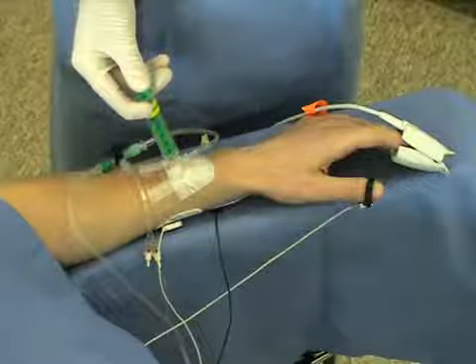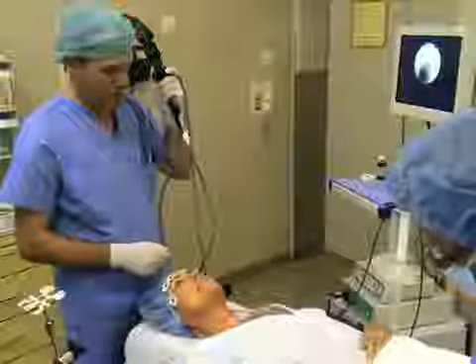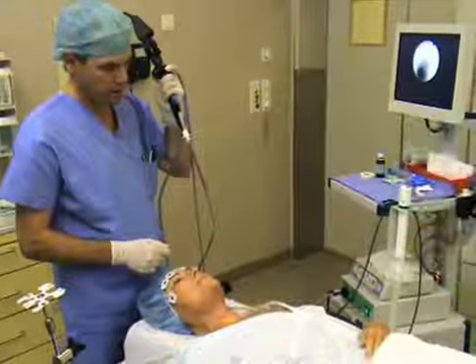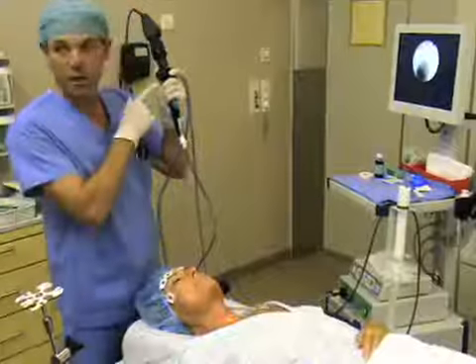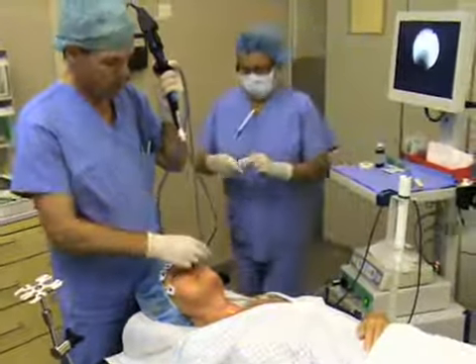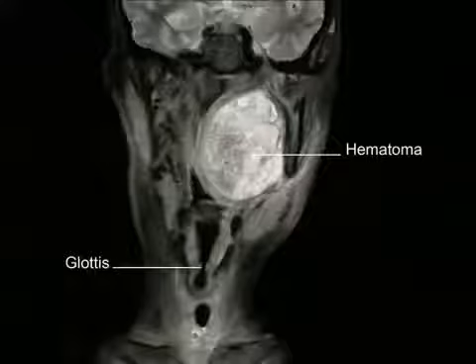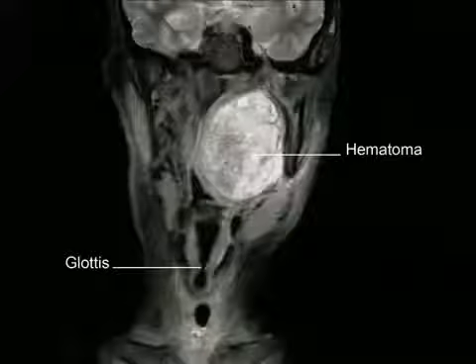The administration of a hypnotic before advancing the tube in patients without a severely compromised airway increases patient comfort and may also decrease the reluctance of an anesthesiologist to perform fiberoptic intubation in an awake patient. After the patient loses consciousness, advance the instrument towards the carina. If the patient has a severely compromised airway, do not give any sedating medication, even for the insertion of the fibroscope.